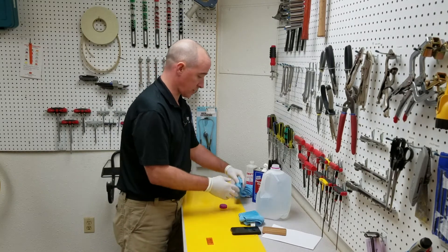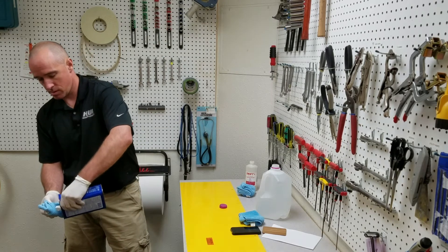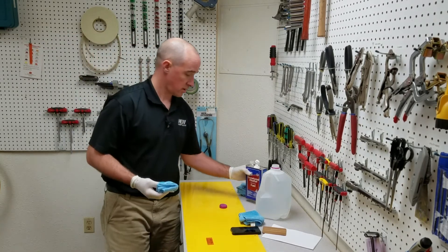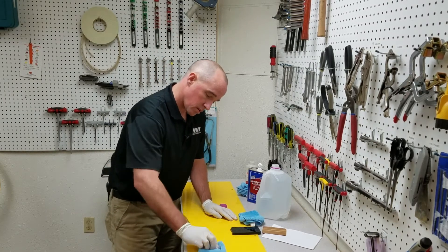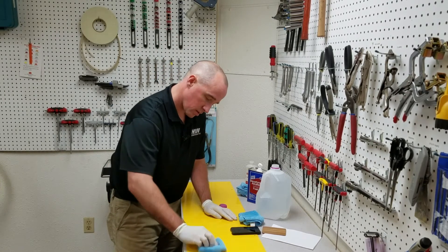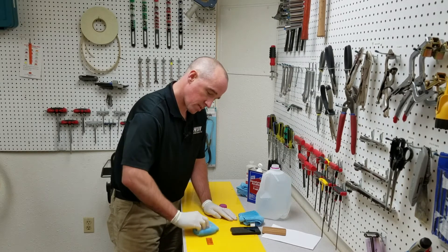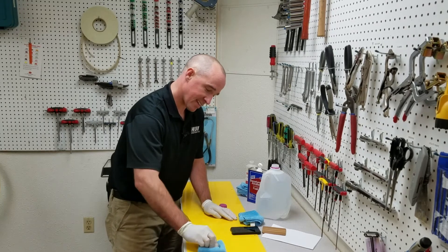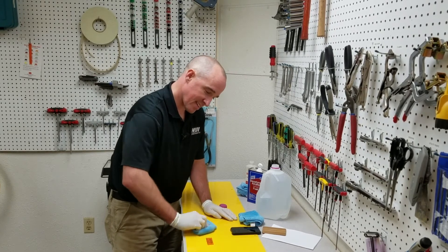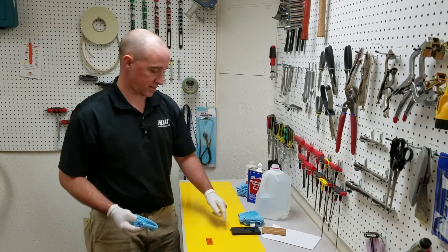Reset our timer, go to our next solvent, denatured alcohol. Okay, that's 15. Looks good so far.